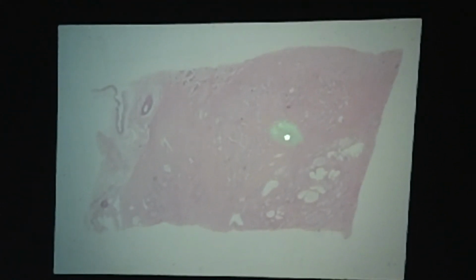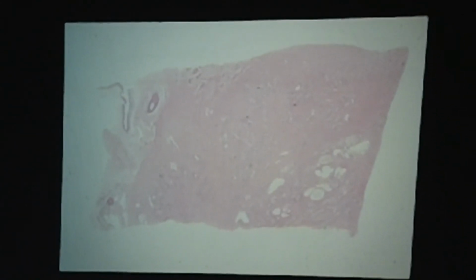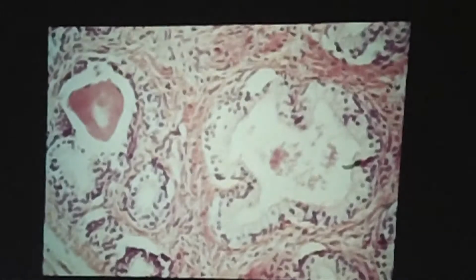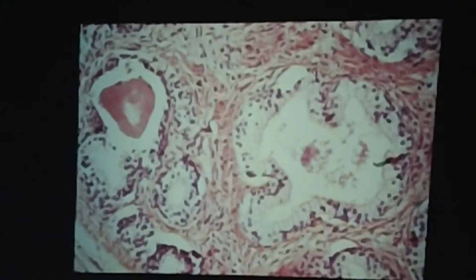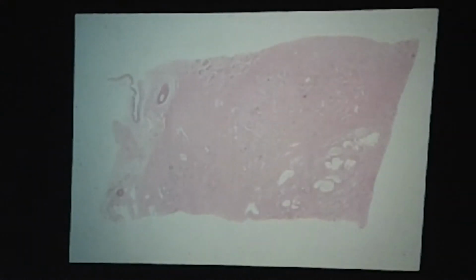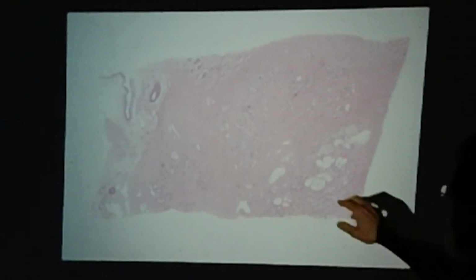This is cool. See these little black? They look almost black, brown. Those are the prostatic concretions. All right? Here's a higher powered prostatic concretion. Oftentimes they look like they have tree rings. So they've been added at different times. The accretion has occurred over time. So they can, like right here, even though they're microscopic from your point of view, they can be brown, yellow, or sometimes pink. But look for the tree ring factor, the concretion, and that'll take you home.